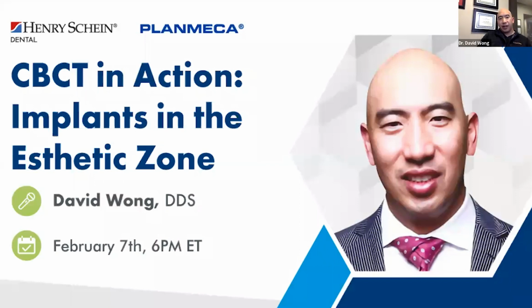Adam, thank you so much, and thank you everybody out there for taking the time to listen to me speak again. So anyway, today we're talking about CBCT in action, which has kind of been the theme for us for a while now, but we're going to focus on implants in the aesthetic zone. Today we're going to see a mixture of some of the cases that I've showed you guys before previously, but we're going to expand on some concepts for those of you who either place or restore implants in the aesthetic zone. So we're going to go over some tips and some guidelines to hopefully, number one, keep us out of trouble, but number two, give us the best result possible for patients. So let's go ahead and get started.